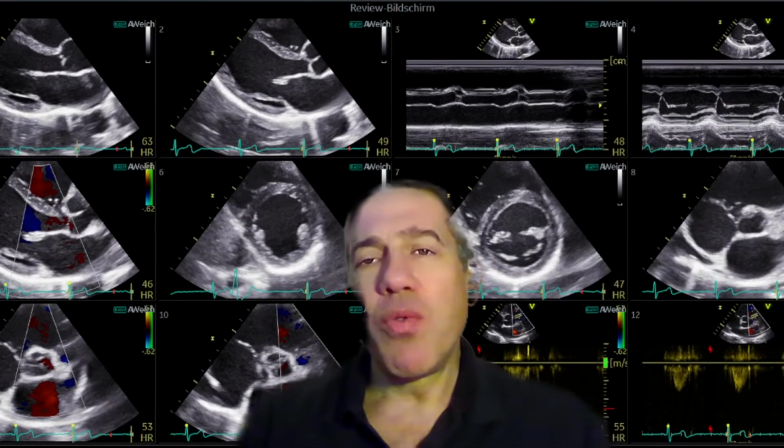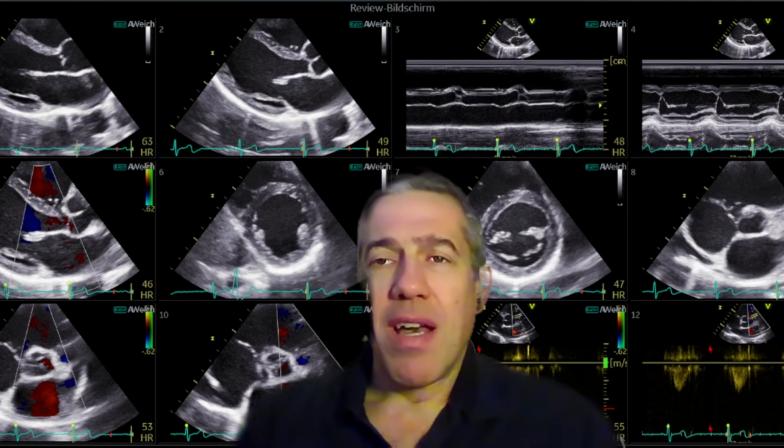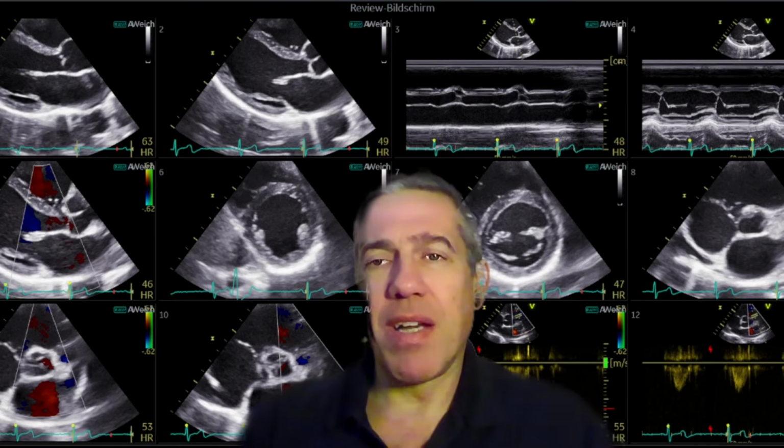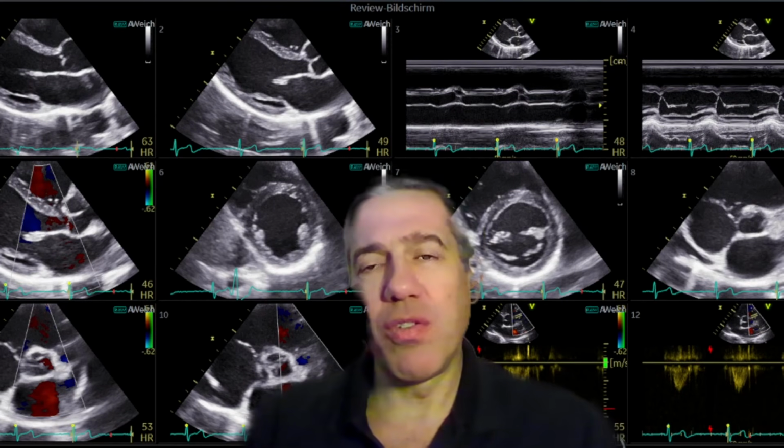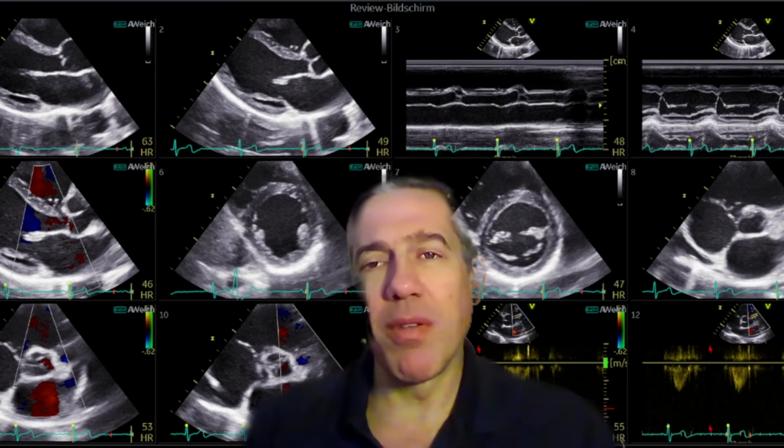So we went through a complete 2D echo exam in detail. I hope you enjoyed it and you learned a bit. I tried to show you what to look at, how to measure a few things. Of course, there's much more to learn, and we just looked at a normal, healthy athlete.